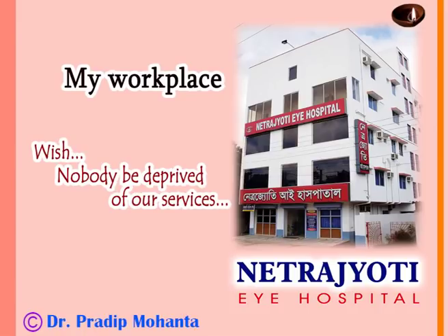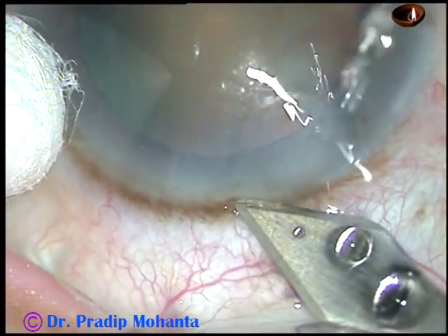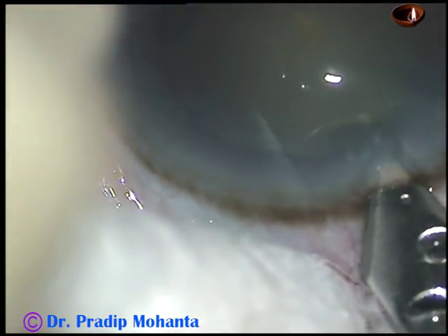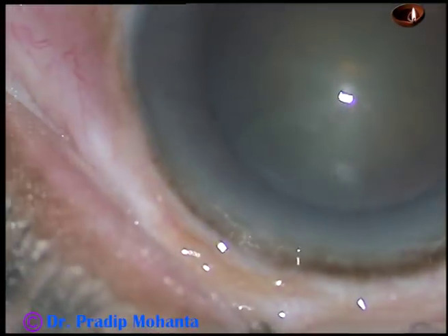Friends, welcome to my hospital at Ranaghat, West Bengal, India. This is a cataract with grade 3 nuclear sclerosis. This kind of cataract is ideal for an eye surgeon to start direct phaco. Let us observe this surgery.